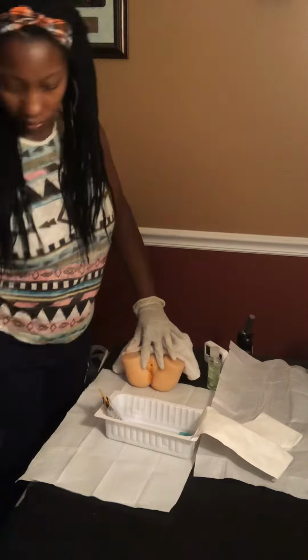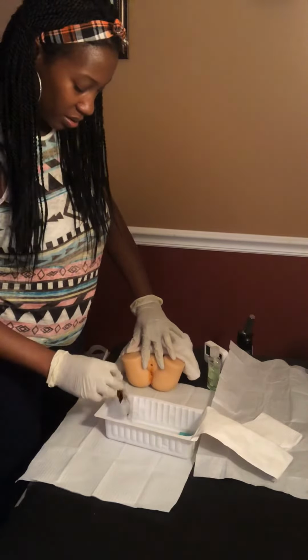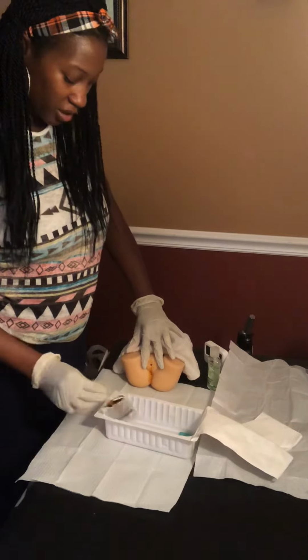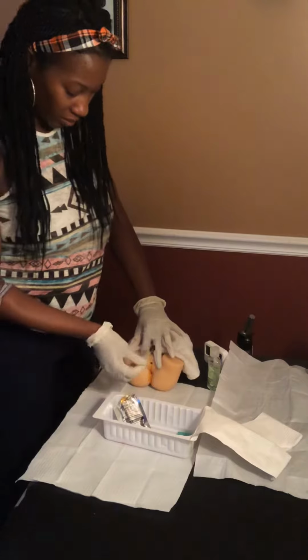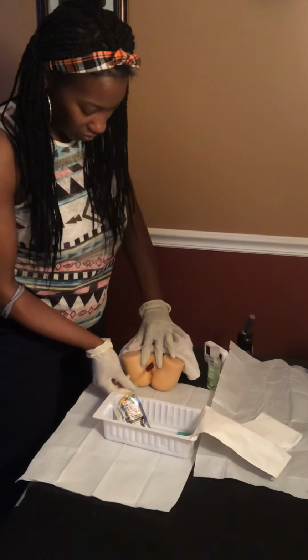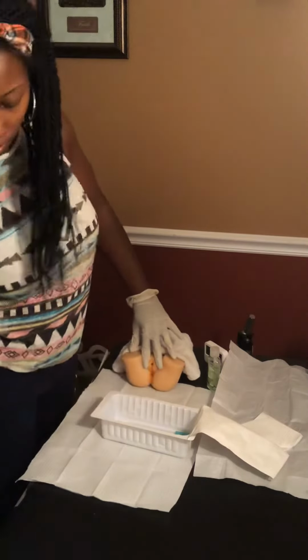Front to back. Center. Center, front to back. Throw that away.